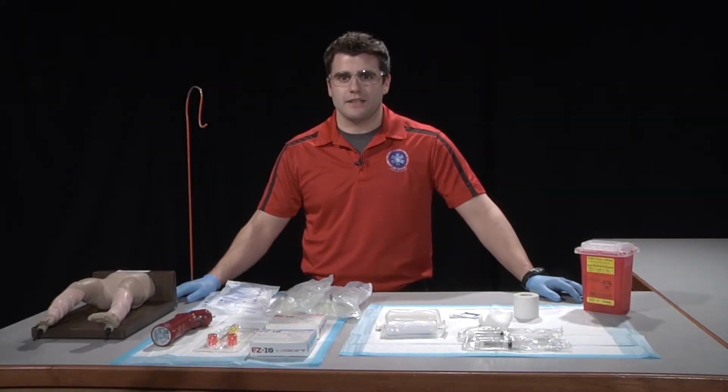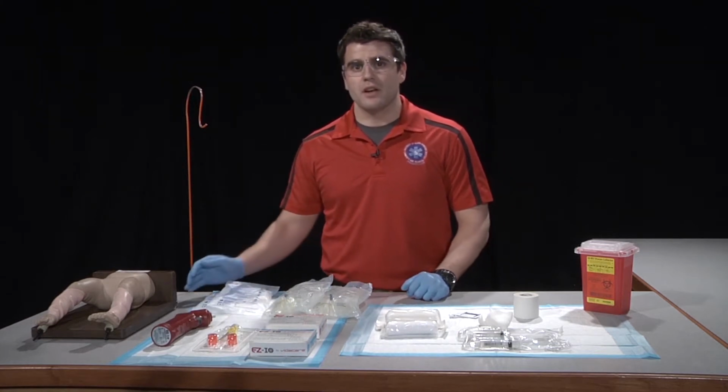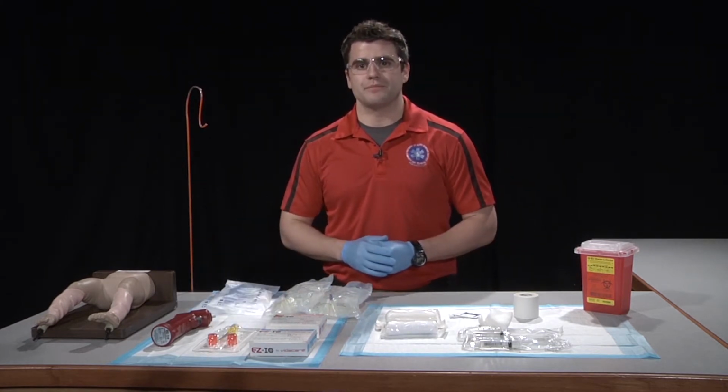This is the Intraosseous Infusion skill. First thing we want to do is explain the procedure to our patient. From there, we're going to go ahead and assemble our equipment.